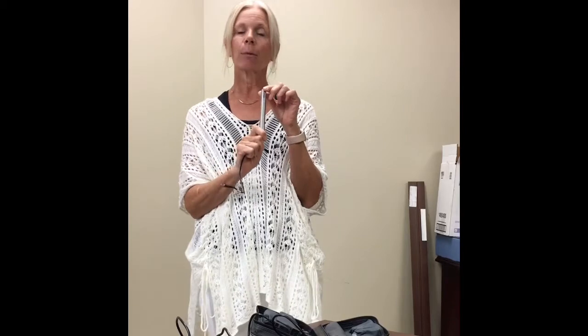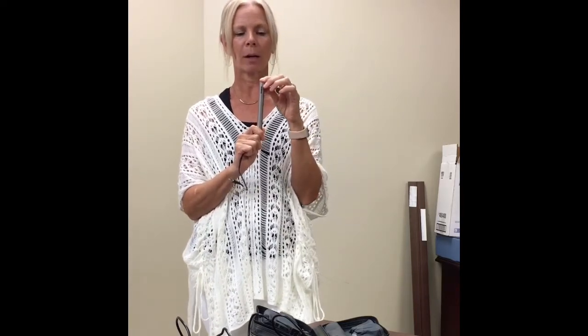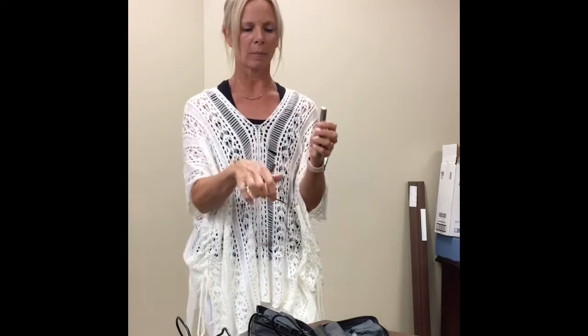You're going to be using what's called the Roger Pen as your microphone in the classroom. Now the Roger Pen looks like this, and it's able to connect to a student's cochlear implant, to hearing aids, or even to devices that we call Roger Focus that looks like a hearing aid but is actually just an FM receiver that your student might be wearing. So I'm going to show you how the pen works.